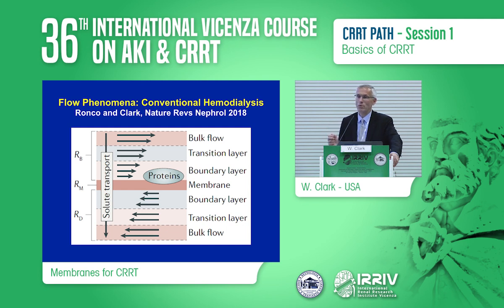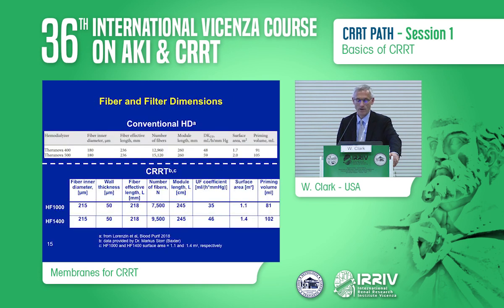So the basic reason why we try to use as high flow rates as possible in chronic hemodialysis or conventional hemodialysis is to dissipate these effects, to decrease mass transfer resistances in both the blood and dialysate compartment, and to make sure in general that those are not, if you will, the rate limiting steps in the overall mass transfer, at least of solutes like urea and creatinine.